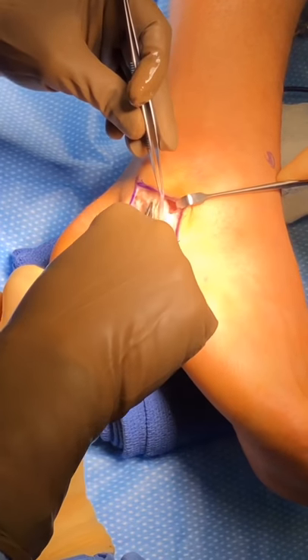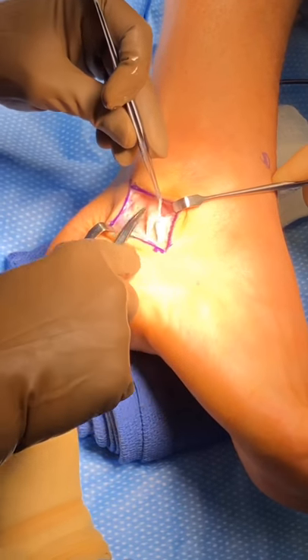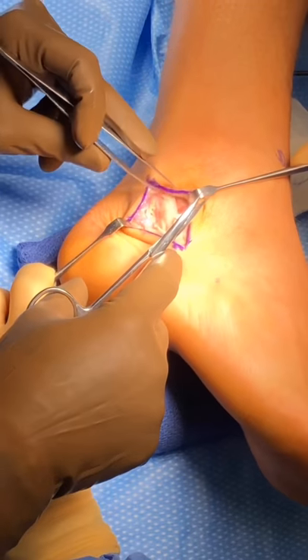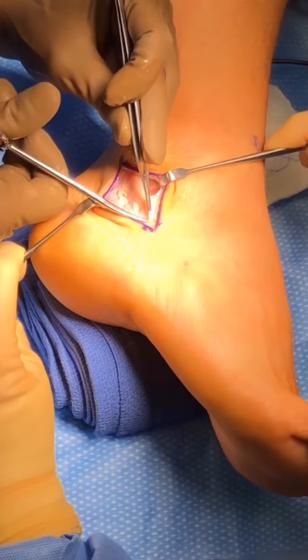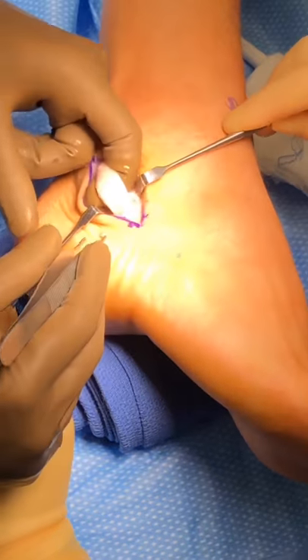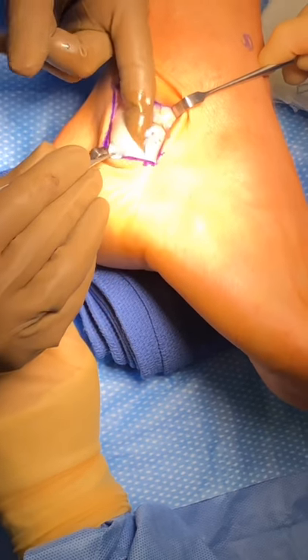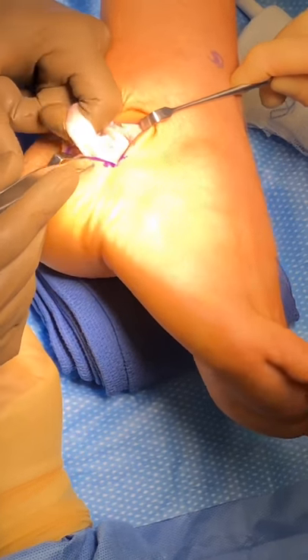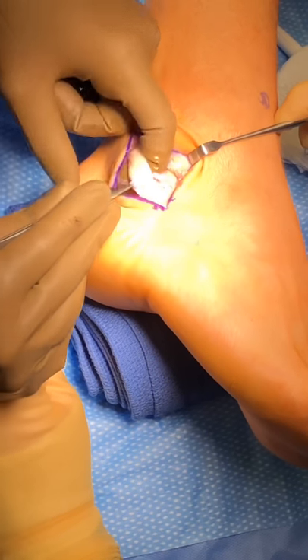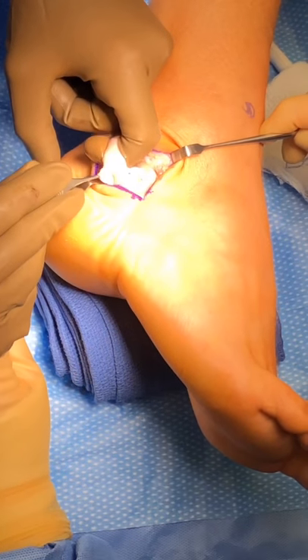Here is one of the peroneal tendons here, and you can see how it is very, very thickened. Okay, so here is the peroneus longus, which tends to be under much more stress in high arch patients, and you can see how it is very thickened and has this hypertrophied or inflammatory tenosynovium surrounding the tendon, and has this thickening and a tear that starts here, right in here.